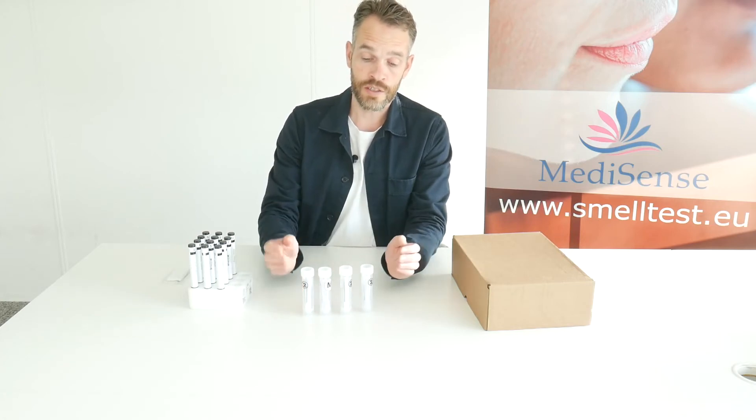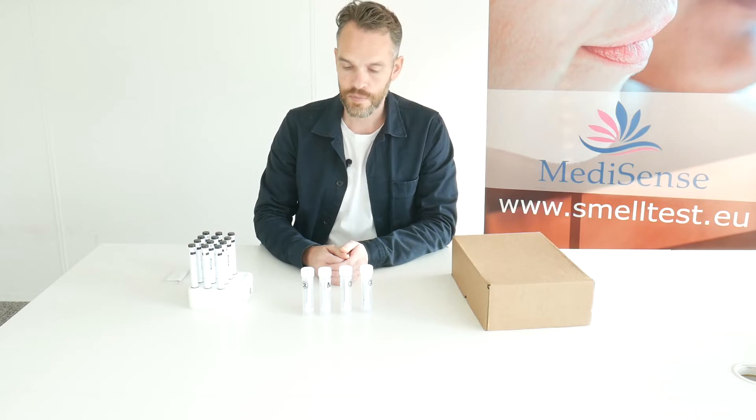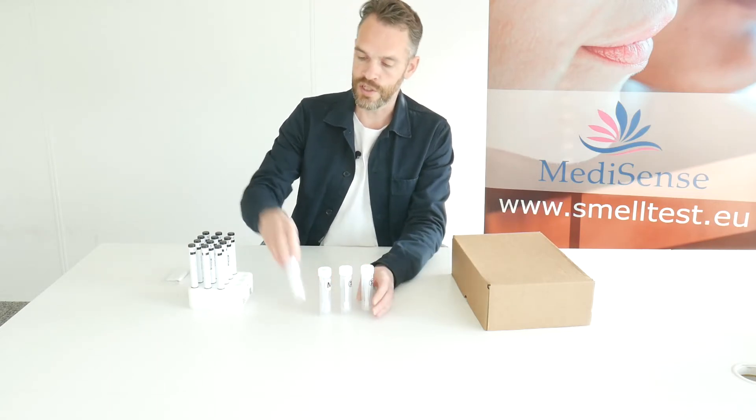If someone fails this test, for example, you can perform the more extended test. Also, these taste strips will be delivered with a tweezer.